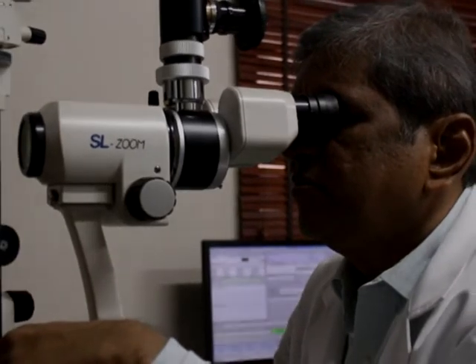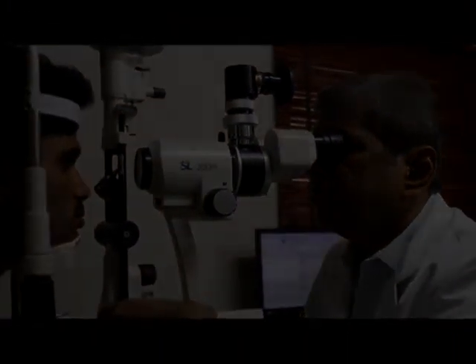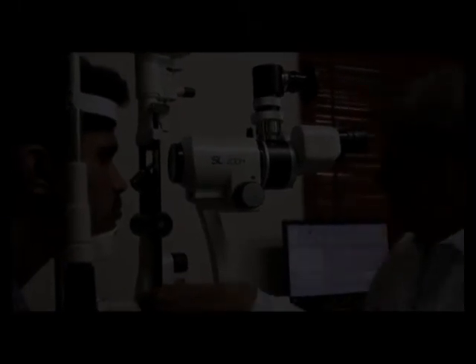Thus, by understanding the basic working principles and mastering the right techniques of usage, the slit lamp biomicroscope can help us pick even the most subtle ocular signs.